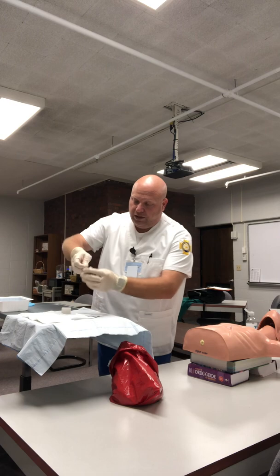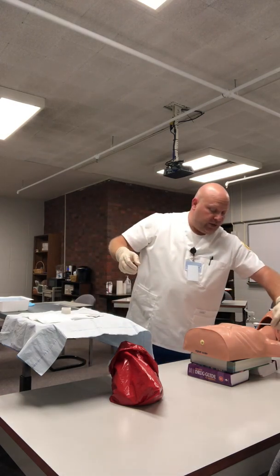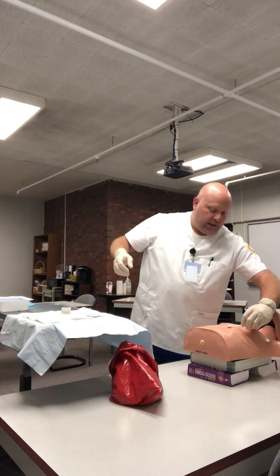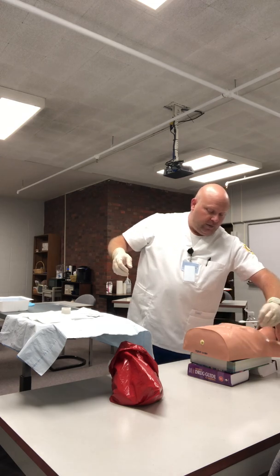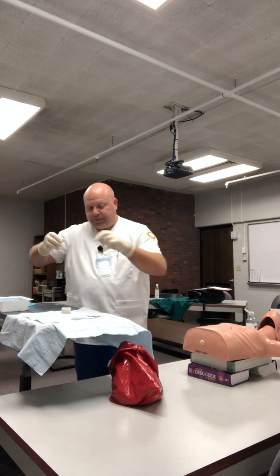My last one, I'm going to put in my non-dominant hand. Without reaching across the sterile field, I'm going to reach the other side, rotating as I go down on the outside of the wound, cleaning one way only. I'm going to come back around. I want to discard that in the trash.